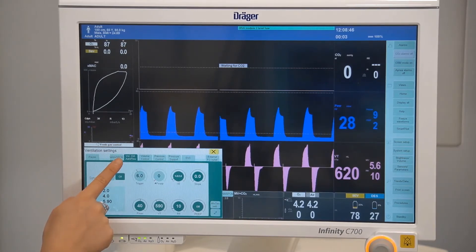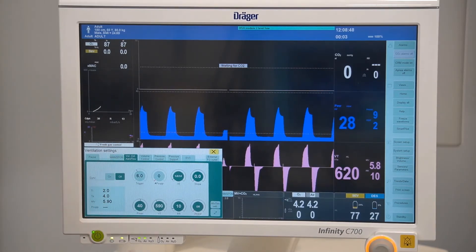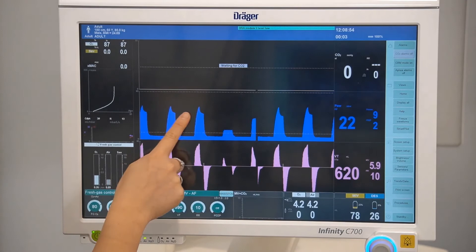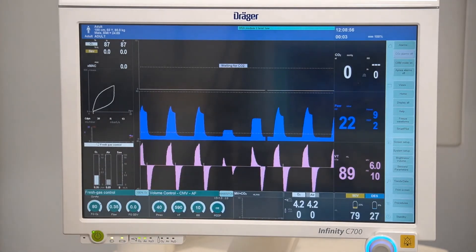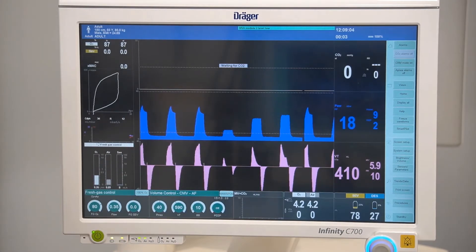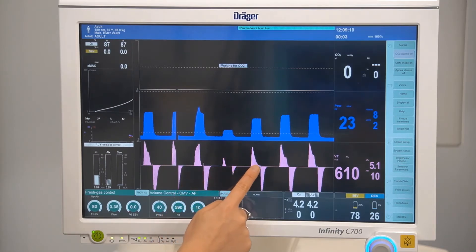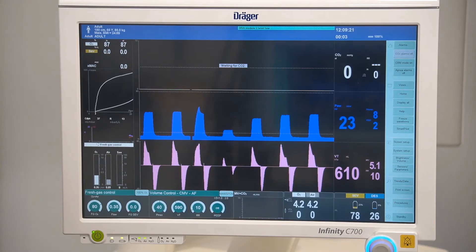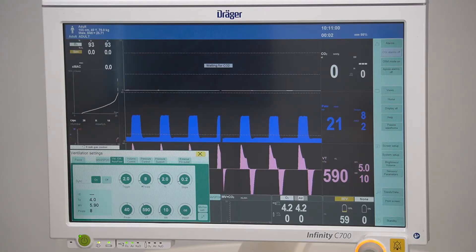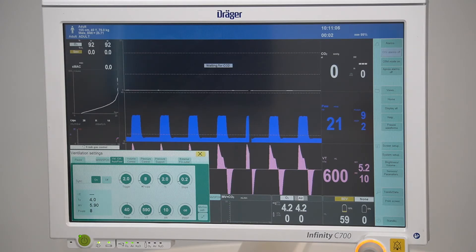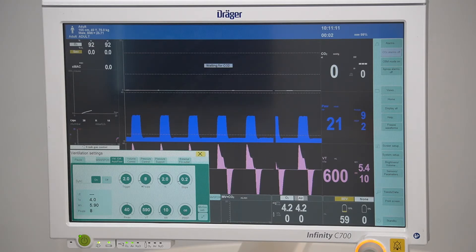In volume control auto flow mode, this will still target your set tidal volume and frequency. However, it will avoid the peak inspiratory pressure as seen in volume mode and will typically achieve a lower peak inspiratory pressure. You'll also notice a decelerating flow waveform. The patient can breathe spontaneously on both pressure levels, meaning they never have to fight against the ventilator. Also, if a patient starts coughing, the system is always open to avoid pressure peaks.